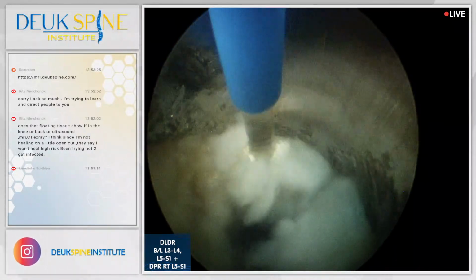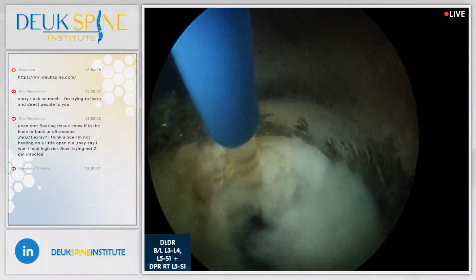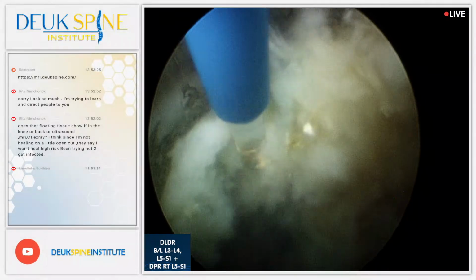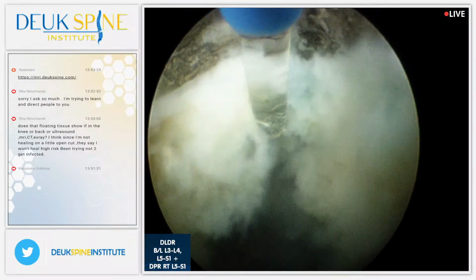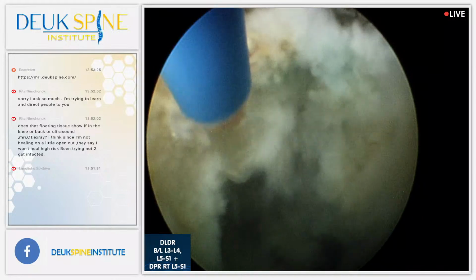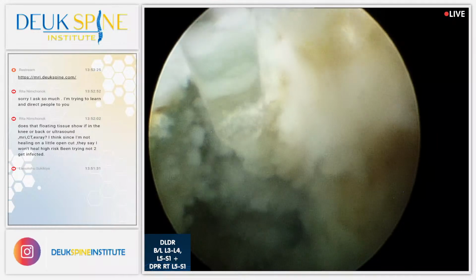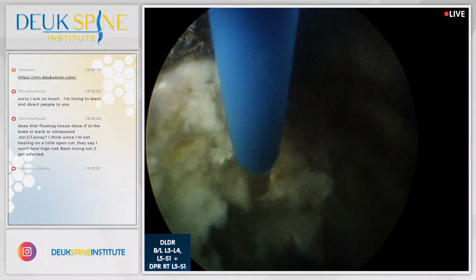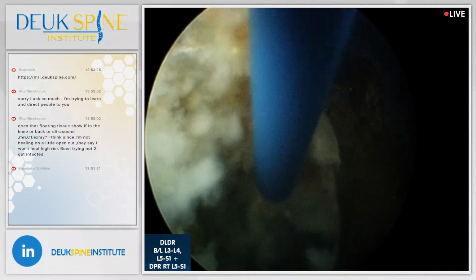Do the MRI review. All right, we're cleaning up the annular tear with the laser. The laser fiber, for reference, is 1 millimeter. That's the clear tube or the clear fiber. That's what's transmitting the laser energy. It uses differential properties in the index of refraction of the materials, you know, water versus glass. And the light basically just bends at the glass-water or glass-air interface. And that causes the electromagnetic radiation to change direction and stay within the fiber until the end, and then it's released right out at the end.